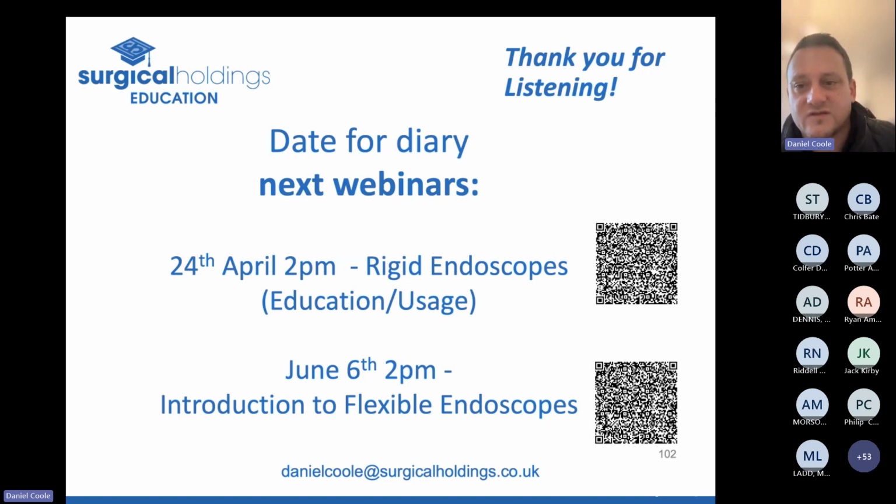In the British Standards, it gives you test materials. They are quite old, so some of them are quite outdated. However, there are like-for-like test materials that you can use. The German instrument manufacturing industry group created a DIN standard that has particular test materials. I think it's got a red test material and a yellow test material for different types of scissors. I think the yellow's for finer, but they'd be quite good. But obviously you'd have to then reference the DIN standard in your procedure. We've got information on that. If you want to drop me a message, I'd be happy to share the information.